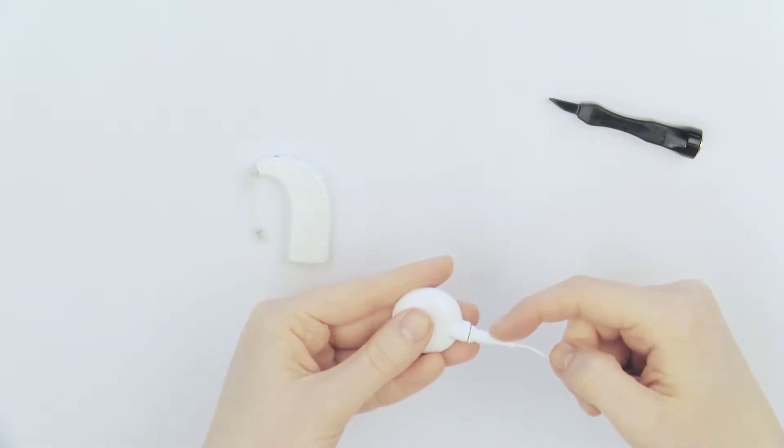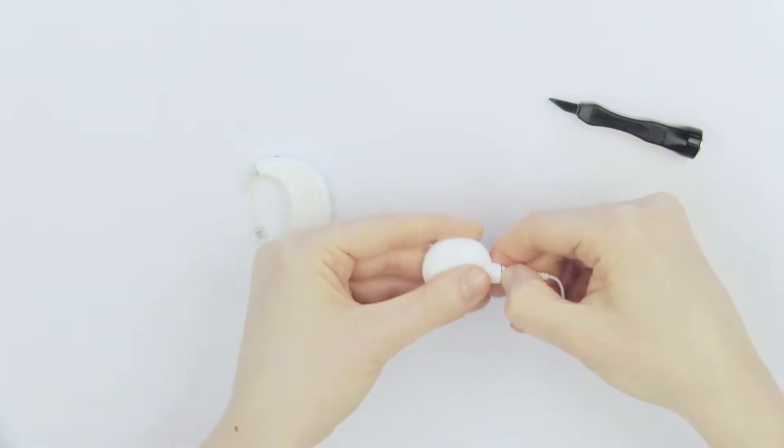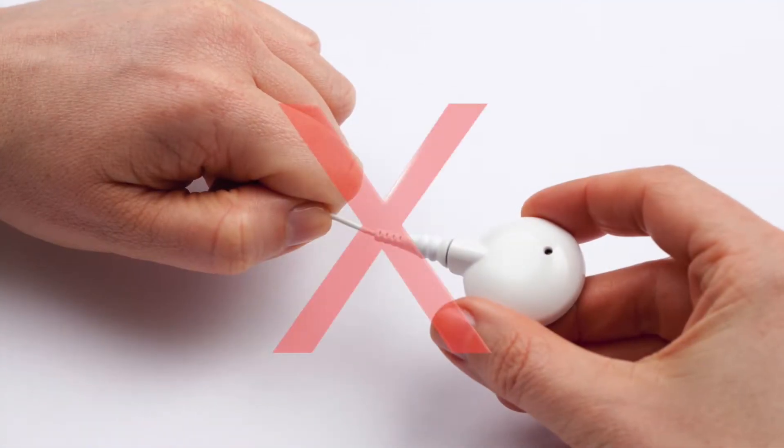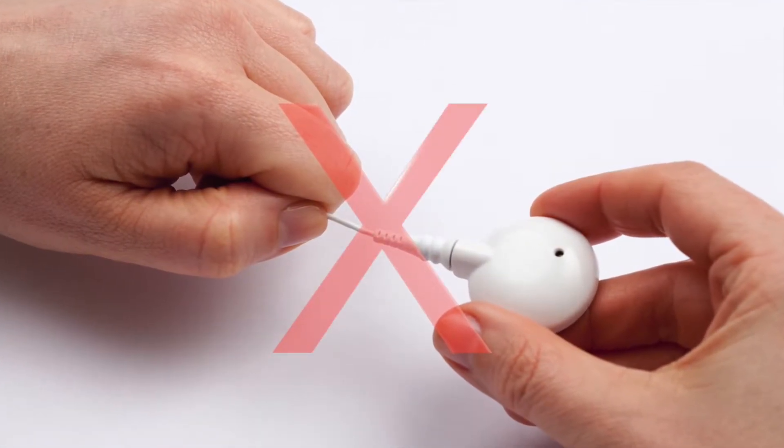Next, grip the strain relief on the other end of the cable. Pull the cable straight out of the headpiece. Do NOT remove the cable by pulling on the cable itself.